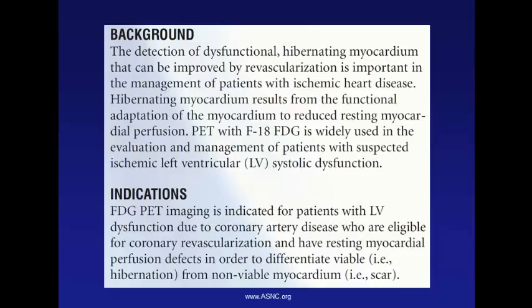Now, I took this slide from the ASNC, the American Society of Nuclear Cardiology website. There is what they call a practice guidelines card, where they give you a little bit of background and some indications, and also a little bit of advice for technicians on how to run a cardiac PET, and I think that's certainly an interesting source.